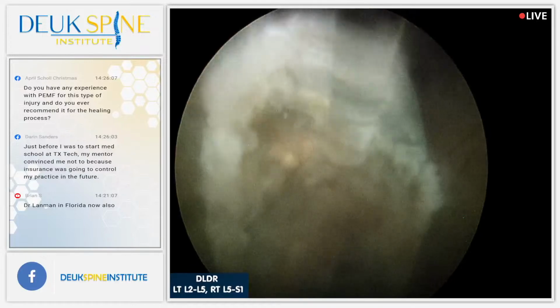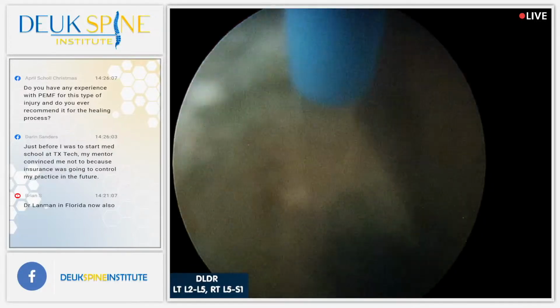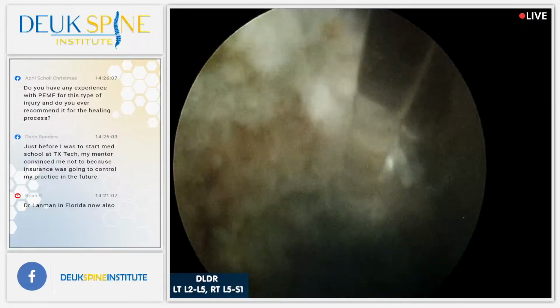Oh, look at all the herniation coming. So we're not quite done. We're very close. But yeah, good times.